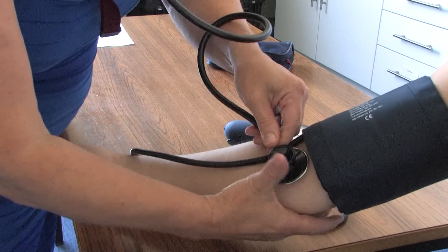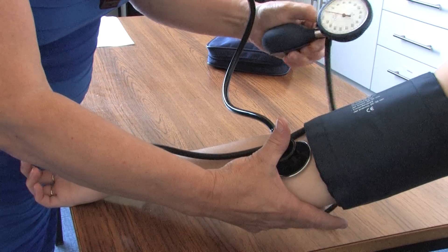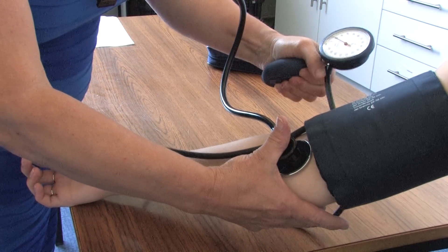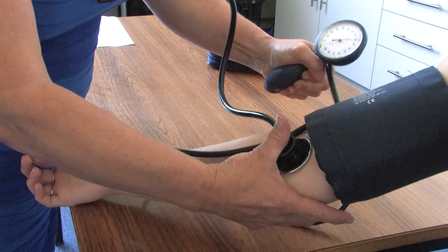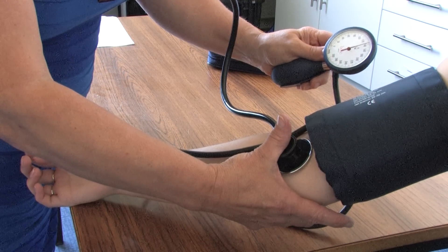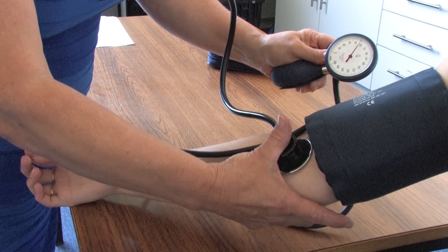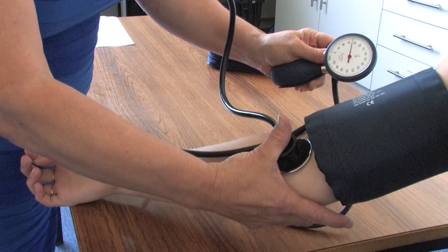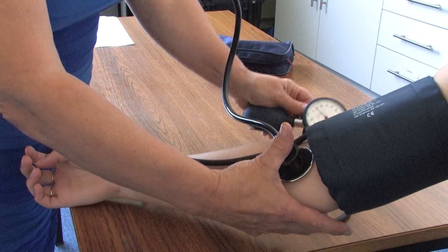Put the ear pieces in your ears and place the stethoscope diaphragm over the site of the brachial pulse. Then continue to inflate the cuff 30 millimeters of mercury higher. Please note: in pregnant women it may not be possible to hear when the sounds disappear completely — Korotkoff 5. Therefore, the start of the muffled sounds, Korotkoff 4, should be taken as the diastolic pressure.